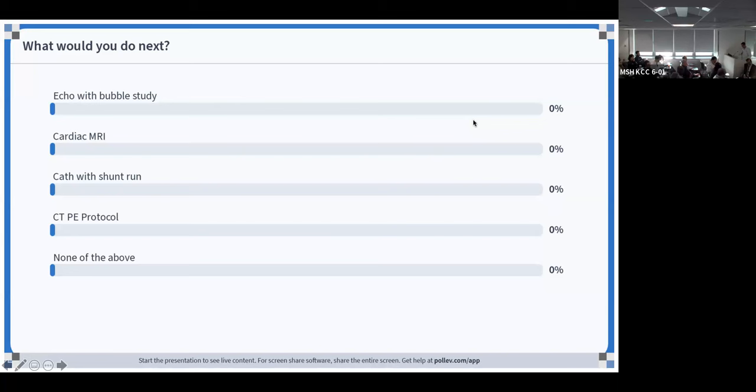And then finally, we definitely look at the pulmonary veins, which are quite tough to look at in adults, but we do that from a parasternal short, and I have to say that we're very happy in an adult to see the lower ones. So if we see the lower ones, we're like, okay, at least the lower pulmonary veins return normally, but we still have RA and RV dilation that we cannot explain, and the upper pulmonary veins are tough in adults. If we see them, great. If we don't, very high index of suspicion that they're going somewhere they should not be going.